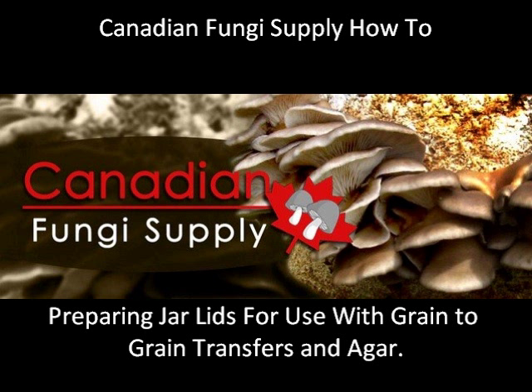I'll show you how to go about using polypropylene lids and filter discs to make this lid design. Here you have a 70mm filter disc and a 70mm polypropylene lid, both of which you can buy from our site, Canadian Fungi Supply.